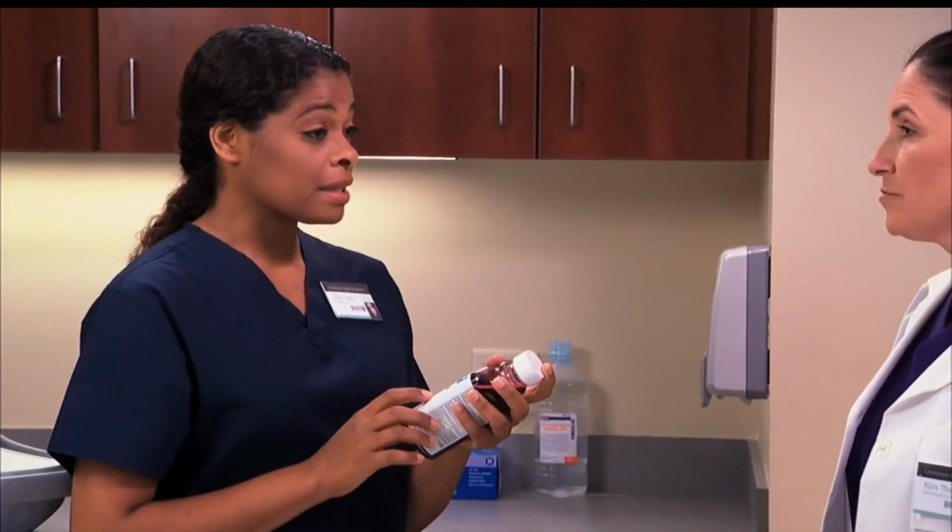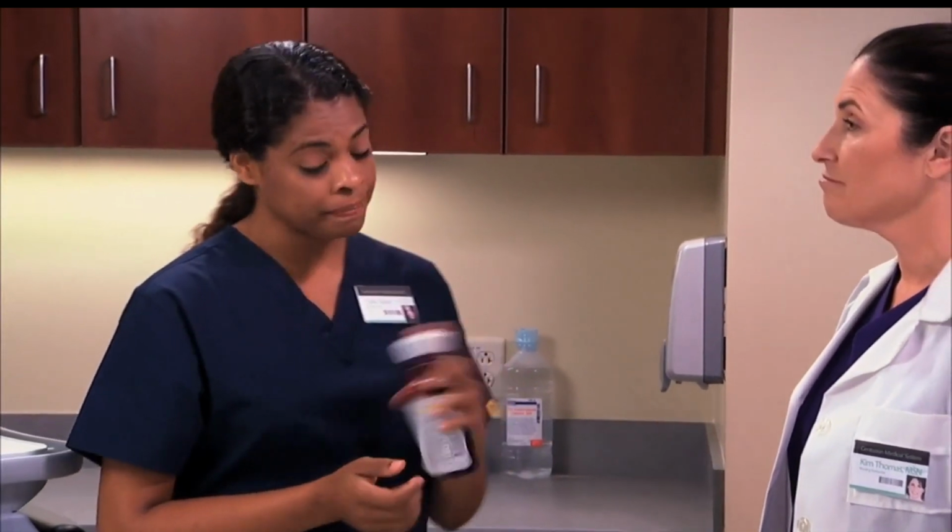Okay, guaifenesin, 400 milligrams. The dose ordered is 400 milligrams. The package is labeled 400 milligrams per 10 milliliters. So let's see. I need 10 milliliters to make the correct dose. Right, very good. And since the guaifenesin is a liquid, you'll need to check the label to see if it needs to be shaken. The label says to shake before opening. Okay.